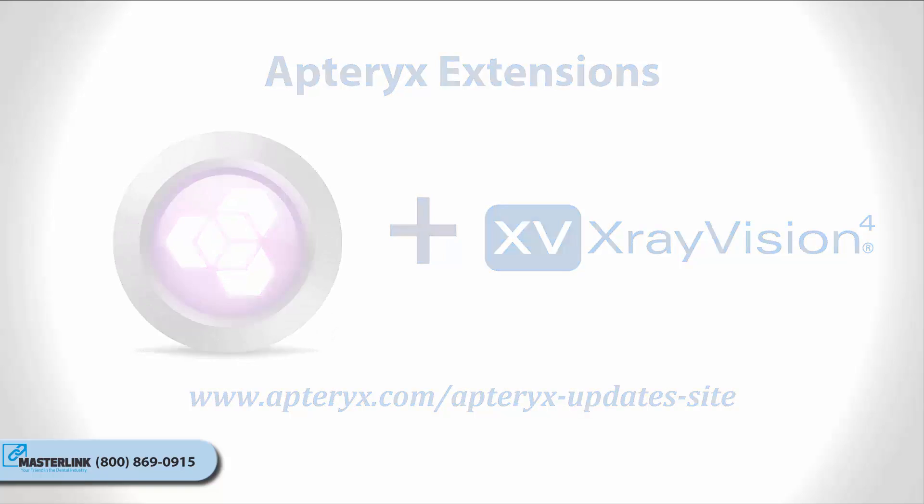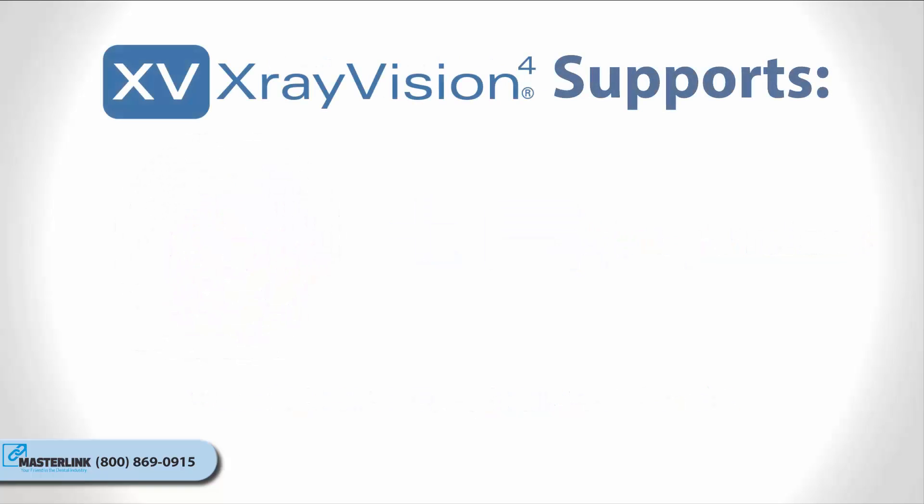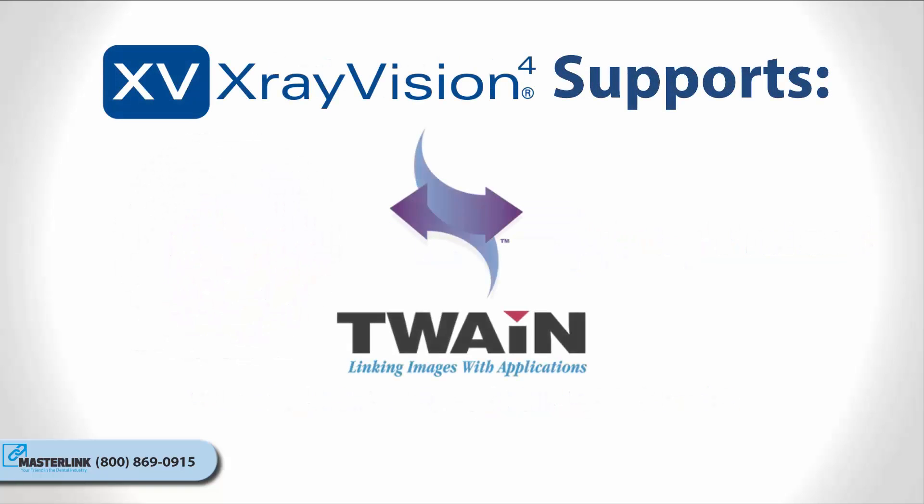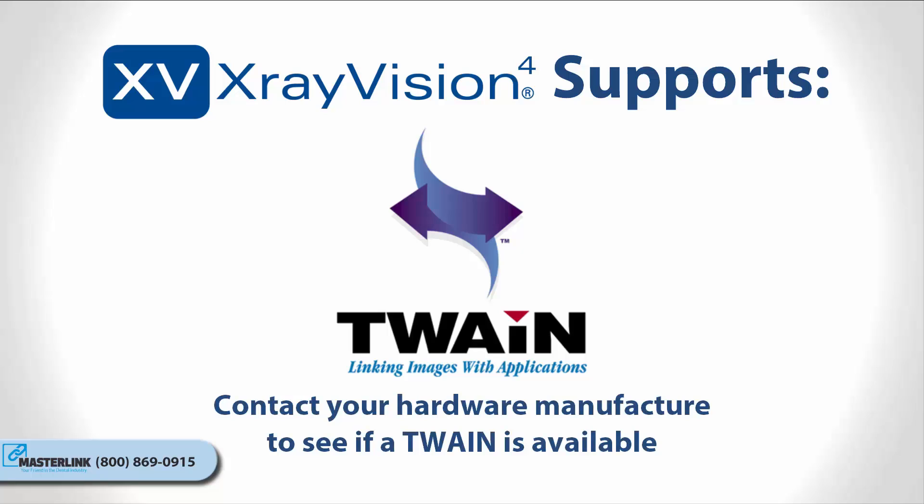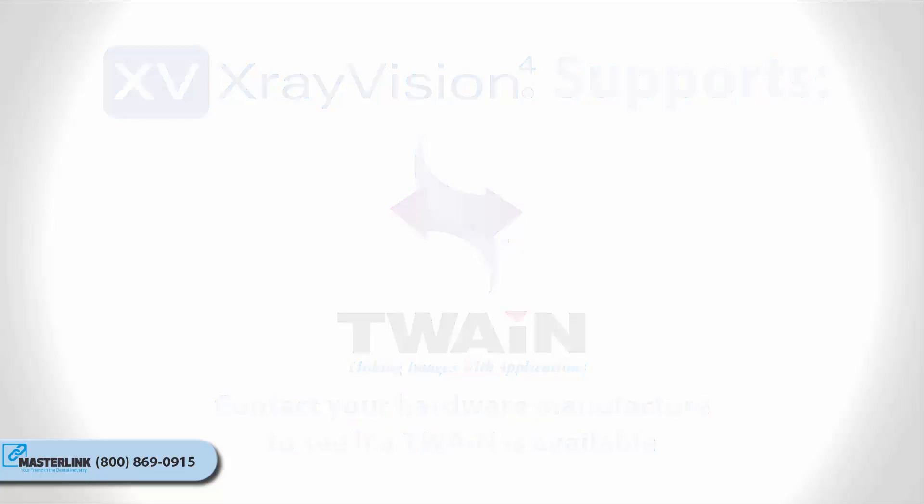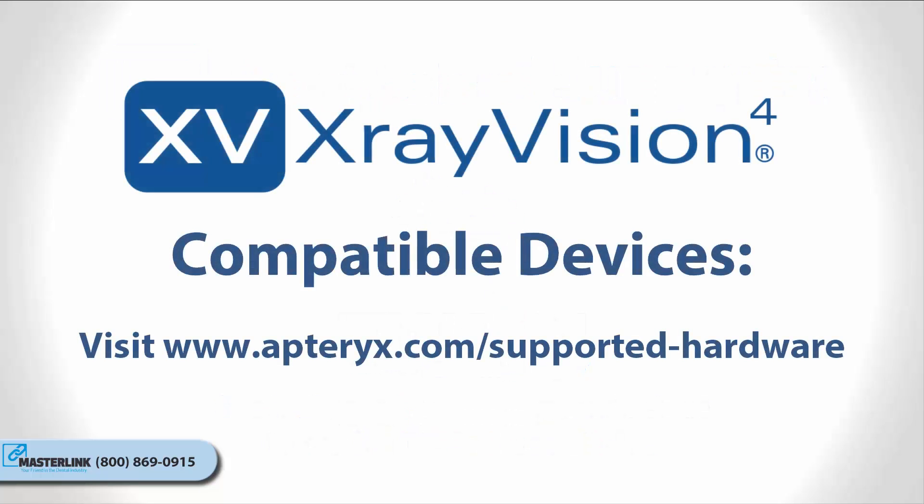If no extension is available for your hardware, a TWAIN driver can also be utilized. TWAINs have their own unique interface but will return captured images into X-Ray Vision. You will need to consult with the manufacturer of your hardware to see if they have any available TWAIN drivers for your device. For a list of Apteryx-compatible imaging hardware, please visit our webpage at www.apteryx.com/supported-hardware.